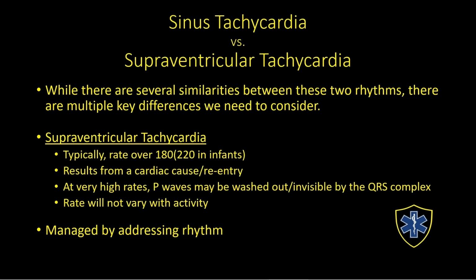Patients will have runs of PSVT, and a lot of times, if they're seen in the ER, even the ER doc says, well, I don't see anything now, but they've had this happen 2, 3, 4 times before. They'll typically be referred to a cardiologist. They may end up with an at-home Holter monitor or some type of at-home monitoring device that's designed to basically continuously record their ECG and try to catch one of these runs of PSVT when it happens. This can be common in teenagers, and may be especially seen in teenage females.